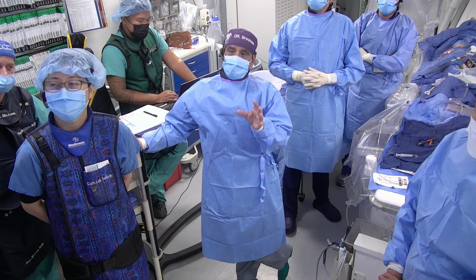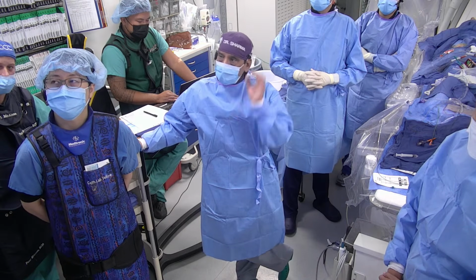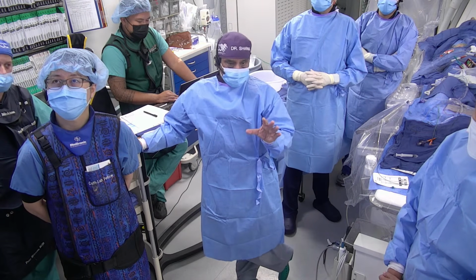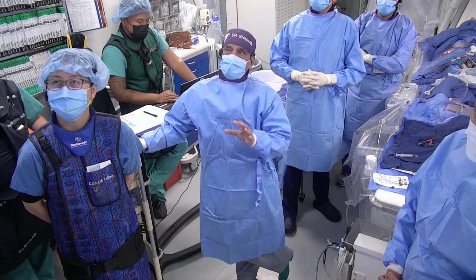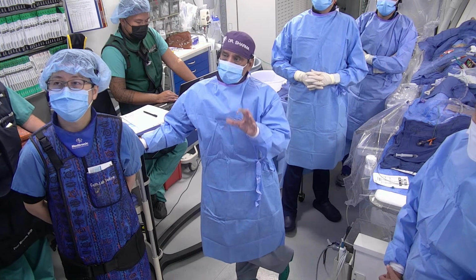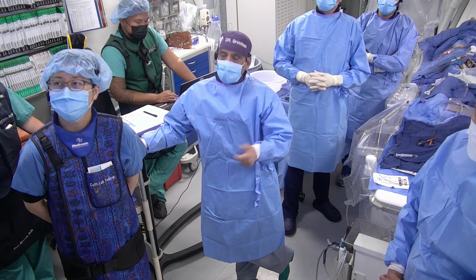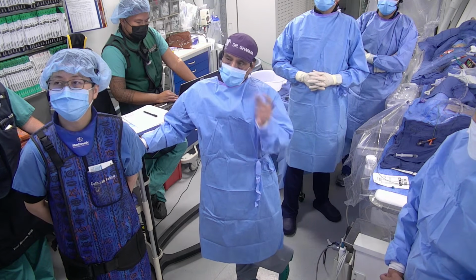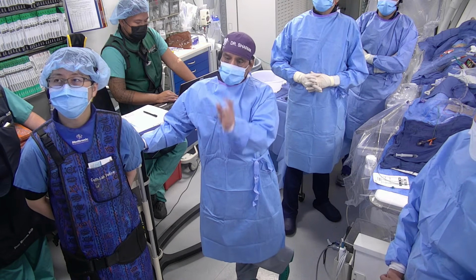Even in the EBC main, 22% require a second stent. So clearly, side branch plaque shift is a common phenomenon and can be taken care of the majority of the time with balloon dilatation, kissing balloon. But if you still have compromised flow and dissection, then you require putting a second stent. So that is part of the provisional stent approach, but a provisional approach requiring a second stent.